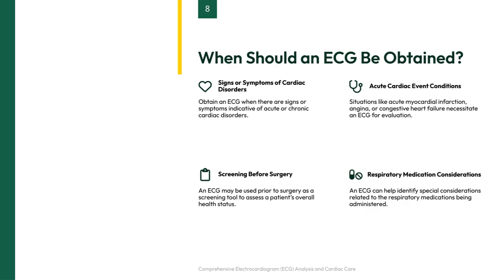In cases of acute cardiac events like a heart attack, angina, or congestive heart failure, an ECG is essential to quickly evaluate the heart's condition and guide immediate treatment. It's also important to perform an ECG before surgery as a screening tool to assess the patient's overall heart health and reduce potential risks during the procedure. Additionally, when respiratory medications are being administered, an ECG can reveal any special considerations or side effects related to these drugs, ensuring patient safety throughout treatment.